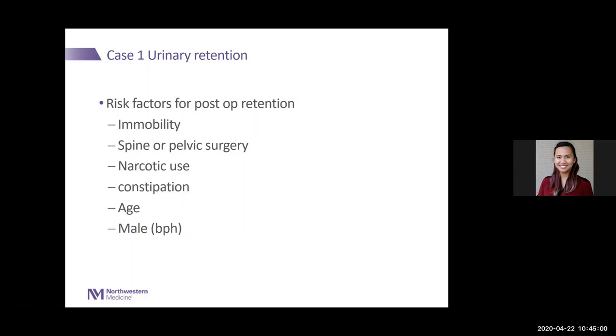The patient can't pee. You know the patient can't pee. Put a catheter in them, fill them up with the urodynamics machine, they're still not going to be able to pee. So it doesn't really help you. Now, if this drags on or the patient had pre-existing symptoms and it hasn't resolved in a certain amount of time, then you may want to do it, because maybe the patient does need an outlet procedure. Men, no offense, sometimes ignore their symptoms. So maybe the patient is pretty clinically obstructed and the procedure tipped them over the edge.